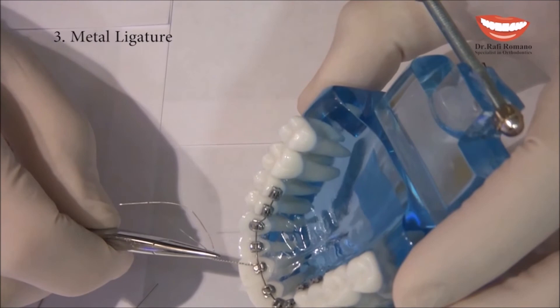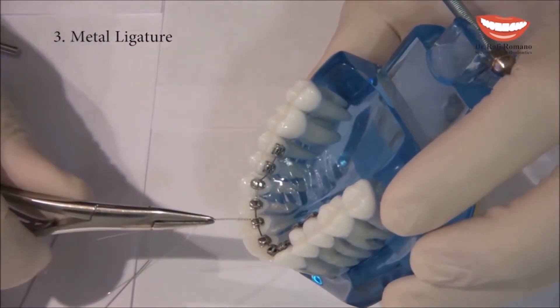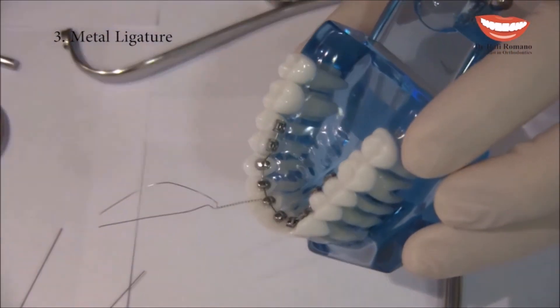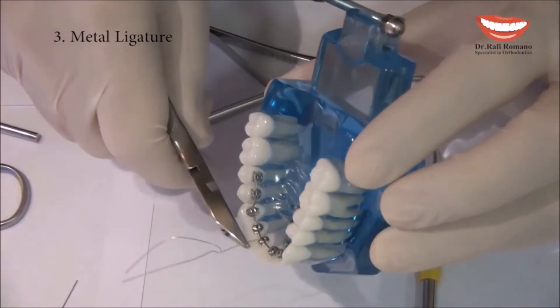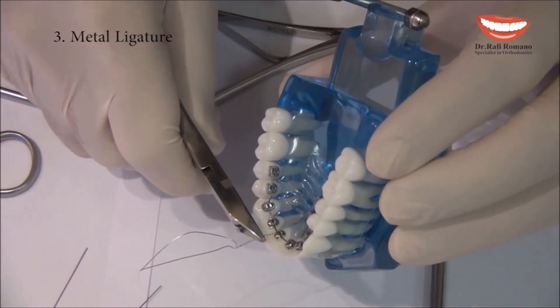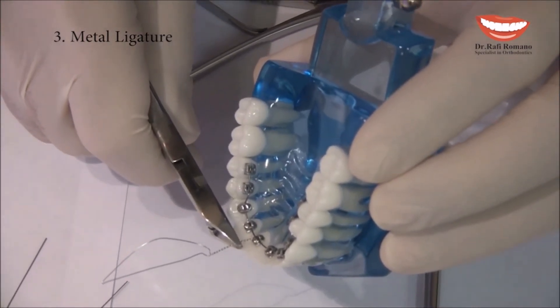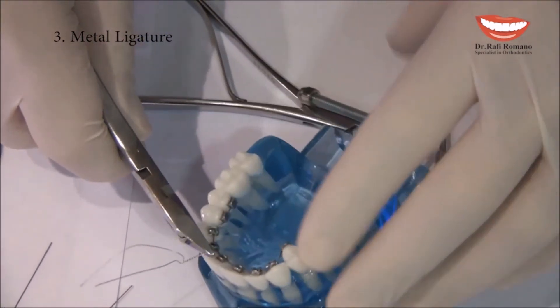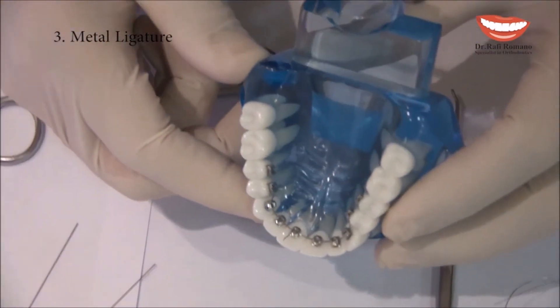I continue wrapping until everything is nicely secured. Then I cut, leaving around 3 mm of wire extending so that I can bend it. I cut as you can see here.